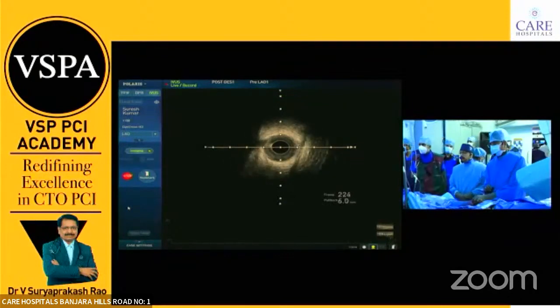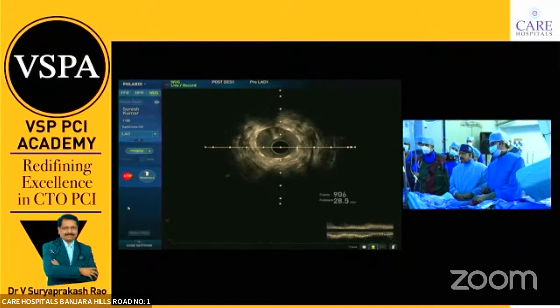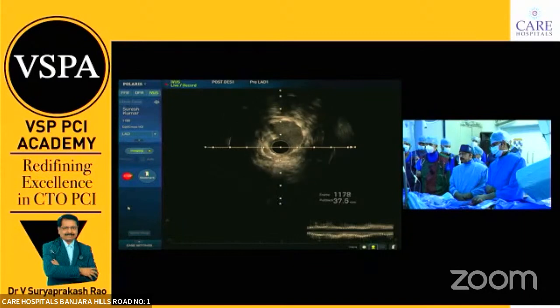IVUS recording after the stenting with high pressure dilatation. No edge dissection, and the distal stent looks well apposed, acceptable. There's an overlap of the stents of the 2.5 and 3. That looks okay.